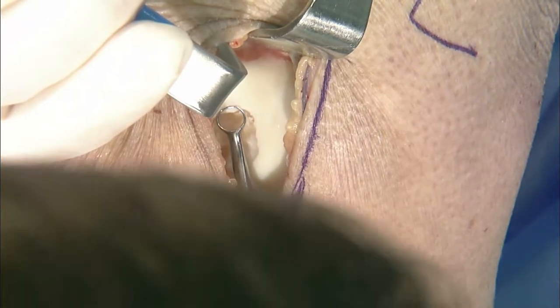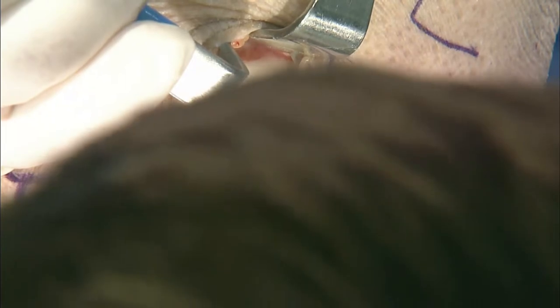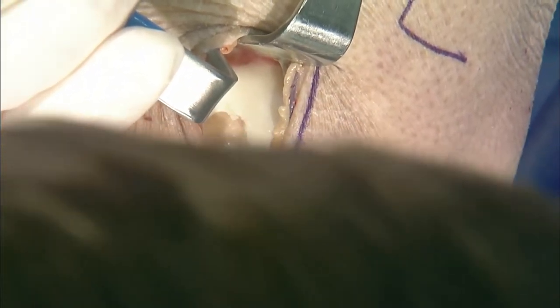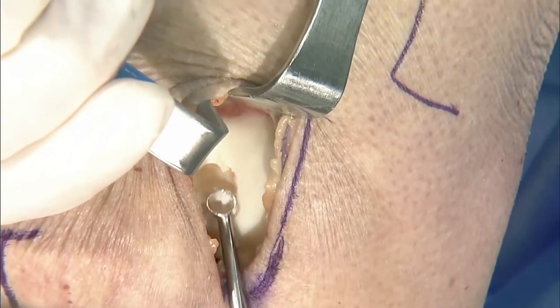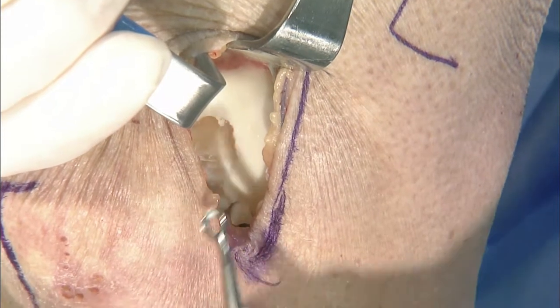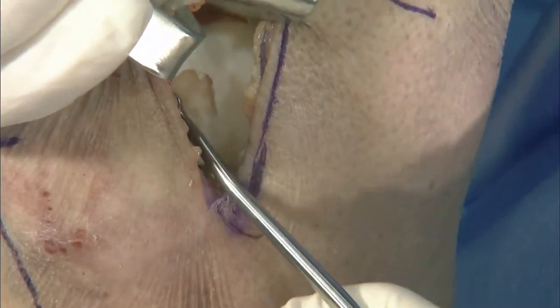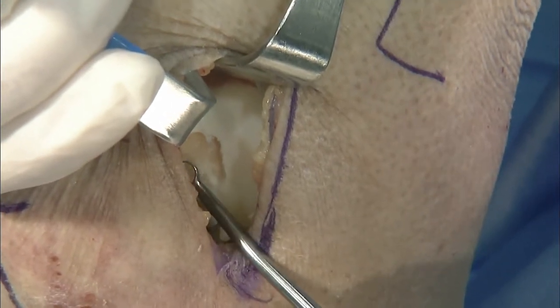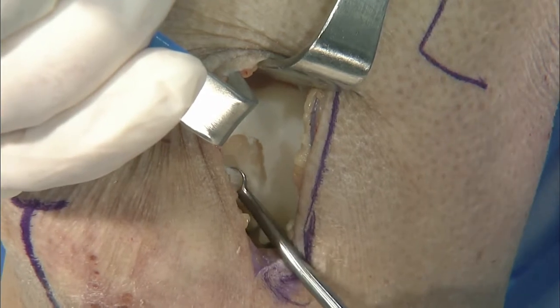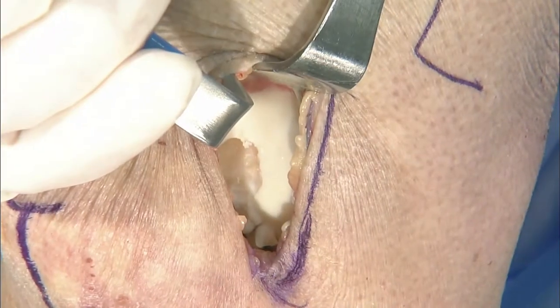And I think the same thing goes for when you're debriding a cartilage defect and taking your biopsy. A lot of times I ask for my elbow curettes because the angles are better for especially getting to the patella, and a lot of times to just cartilage defects in general. So if I think somebody has a legitimate defect, I usually try to have those available for the arthroscopic portion. And then the other thing that I don't know what other sizes you have, Jeff, but usually it's nice with the ring curettes to start relatively larger so that the same amount of force you put down is over a larger area, and hopefully you're not going to violate the subchondral bone immediately.